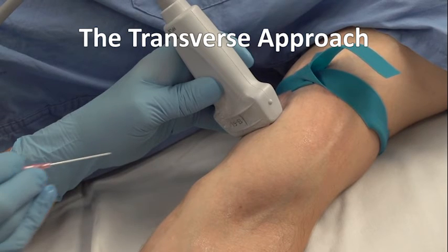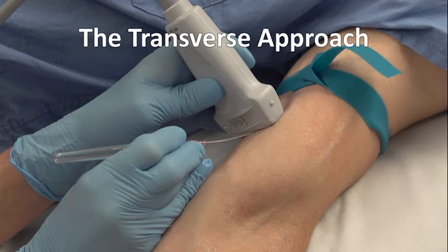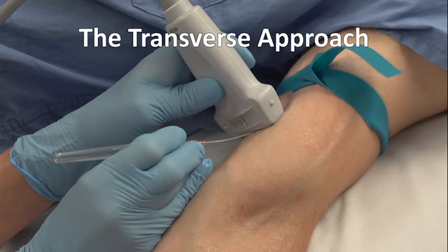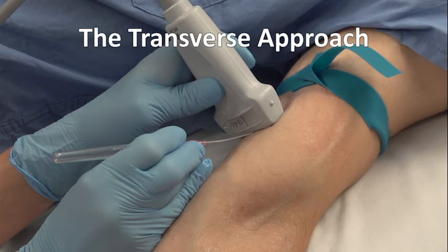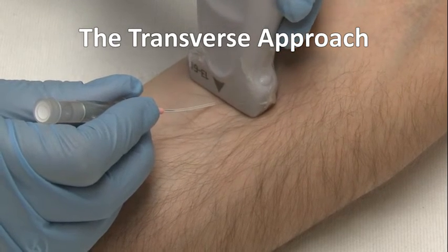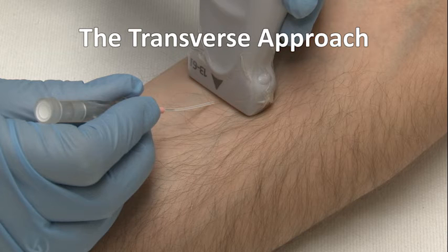For the transverse approach, align the needle very close to the probe's surface at a 45-degree angle with the needle tip directly abutting the center of the probe. Some probes have markers to denote the probe's center line; however, you may just have to estimate this. Make sure not to touch the needle tip to the probe. If you are concerned you cannot see the needle tip, you may simply angle the probe slightly toward the needle to see the tip as it enters the skin, without risking contaminating it.